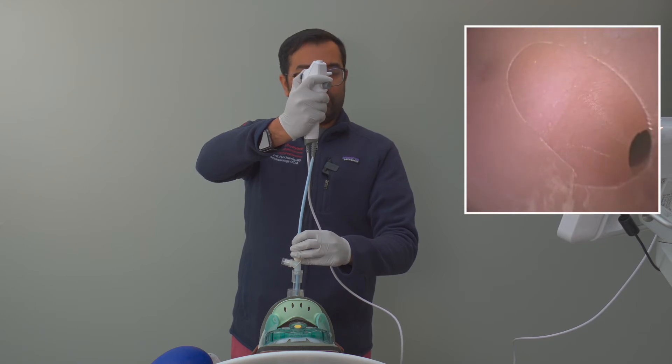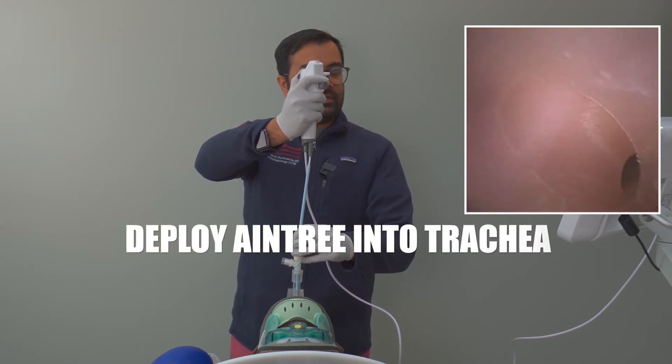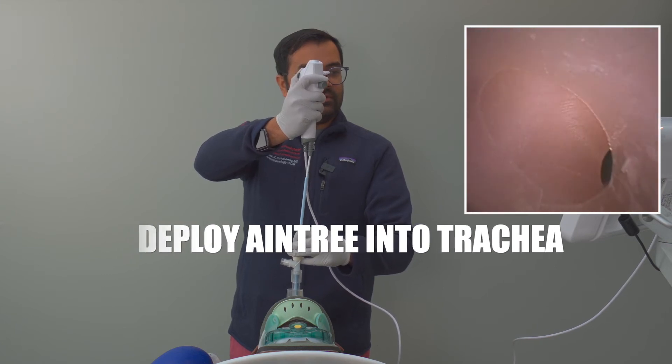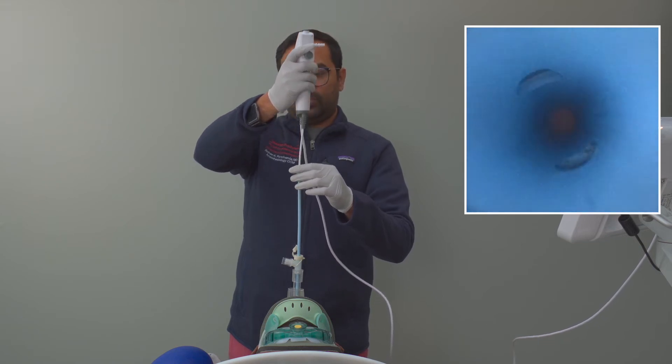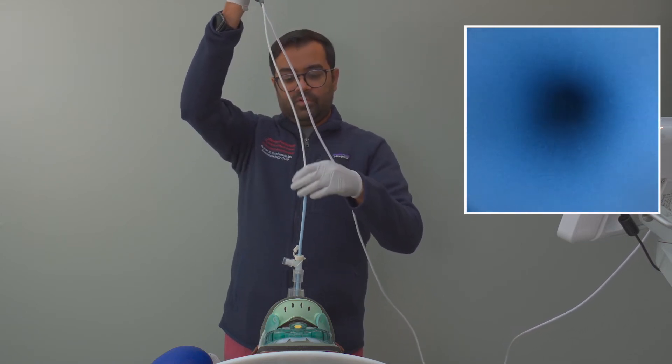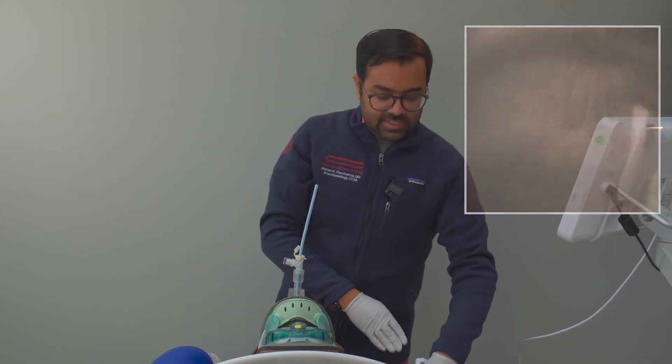You can see here we're at the carina. So at this point we're going to deploy the Aintree catheter under direct visualization. You can see it's positioned right above the carina, confirmed with the bronchoscope. And now we'll pull out our fiberoptic bronchoscope and save it for later.